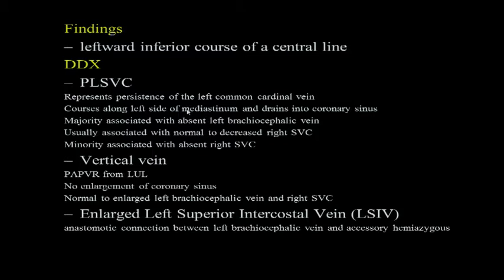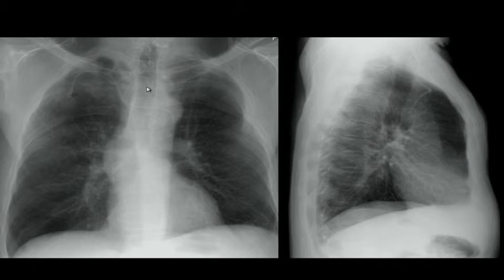I got a question, Dr. Chadha. Yes. Whenever I was seeing this, I was thinking it was the azygos. How would that look different? Correct. If this is on the azygos vein, the most important view is the lateral view. On the lateral view, it'll come down and have a J-shaped appearance. It's called the hook sign. If a catheter enters the azygos vein, it becomes like a candy cane. So remember, it's a mnemonic: azygos vein, candy cane. It's like a sing-song. Here, there is no J sign. If it is in the azygos, it looks like a J.